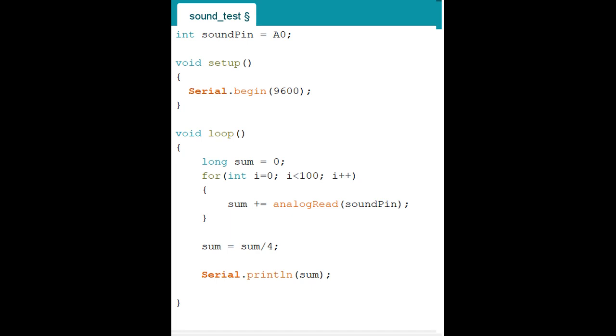So we call it Serial.begin. Serial has to be bold. When you type Serial, it appears as bold because it's a very, very important command. And it has to be capital S. If you don't put capital S, it does not appear bold, I believe. So bold is kind of checking that this is a special language for Arduino, or very, very important. It's like telling you, a computer programmer, hey, you're using this important code, so when you review, it catches your eyes.